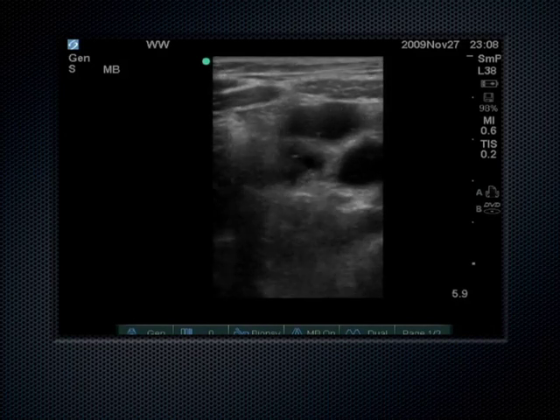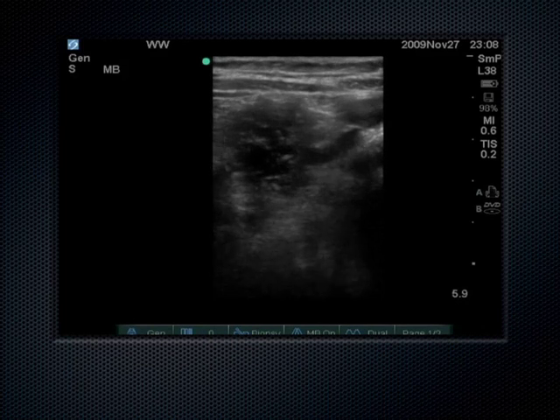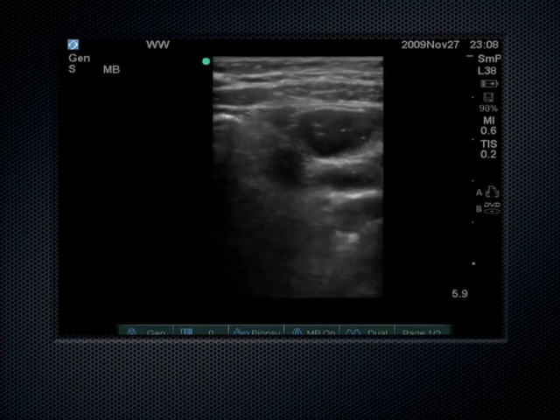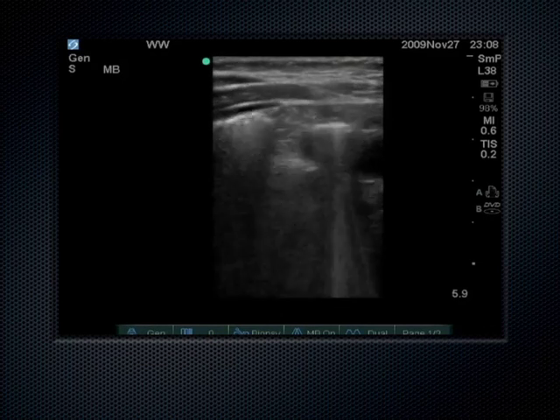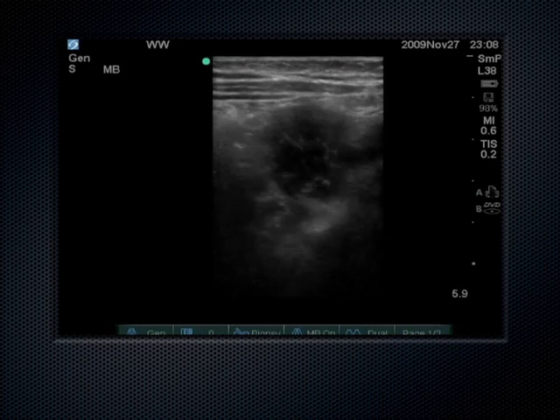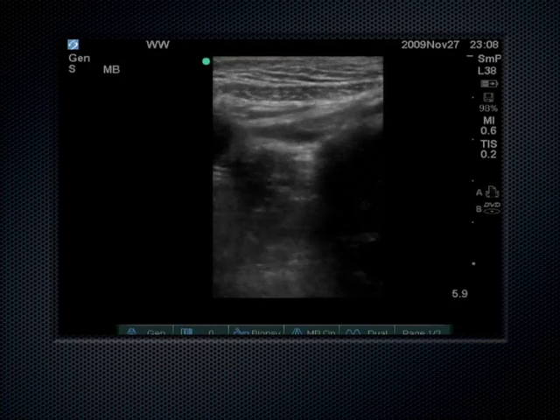Now, if you have appendicitis, all these areas down here in the peritoneal cavity get inflamed. So, it's very painful to be compressing these things. This is the peritoneal lining right here. Okay, I can see that peritoneal lining very easily on ultrasound. Everything down here is all intestines, and there's psoas muscle coming all the way up and coming in contact with the abdominal wall musculature.